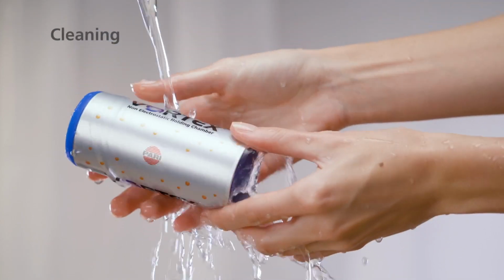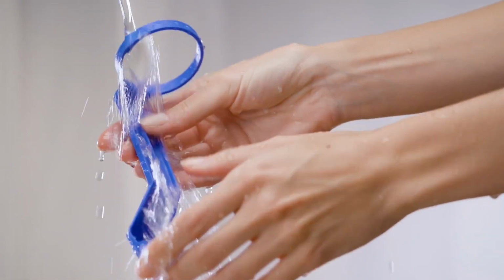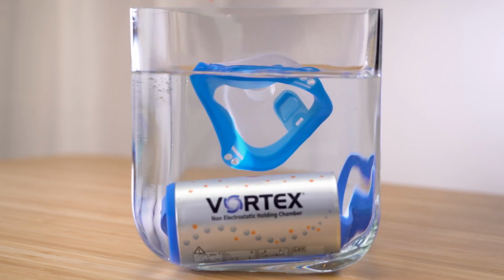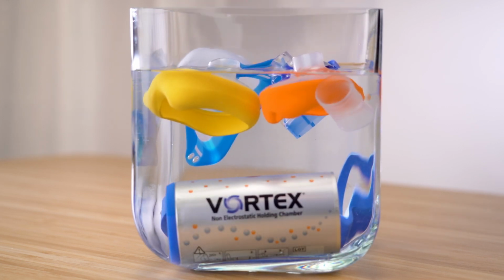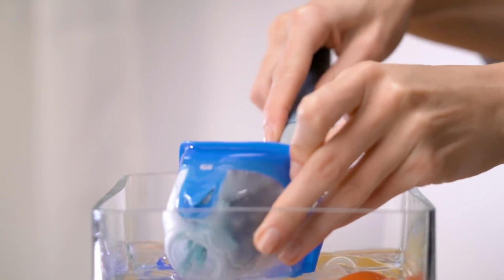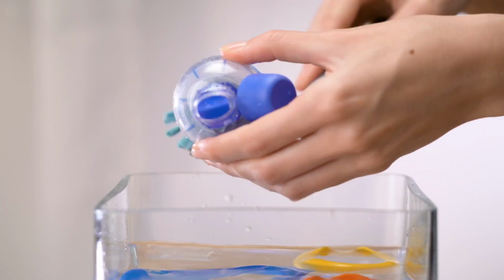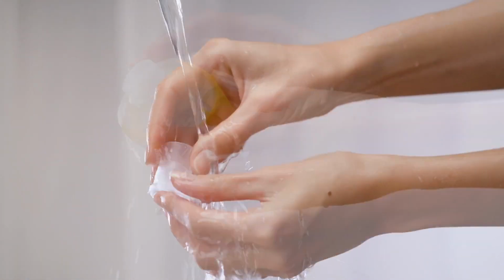Rinse the vortex parts you have used in running tap water for about 2 minutes. Fill a bowl with water and add a little washing up liquid. Soak all the individual parts in the water for about 5 minutes. Occasionally move the parts back and forth. To remove any visible dirt, use a medium soft brush reserved exclusively for this purpose. Rinse all parts thoroughly under running tap water.